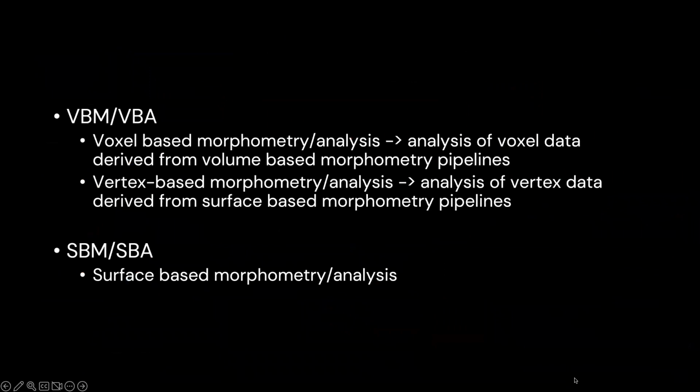Just to clarify, this is something that you should have in mind. You have probably read and heard about VBM or VBA and SBM and SBA. And these terms are sometimes a little bit confusing. So VBM can mean voxel-based morphometry or voxel-based analysis, or it can also mean vertex-based morphometry or vertex-based analysis. If you're talking about voxel-based morphometry, these are analyses made basically from the output of volume-based morphometry pipelines, given that those pipelines use and create voxel maps.